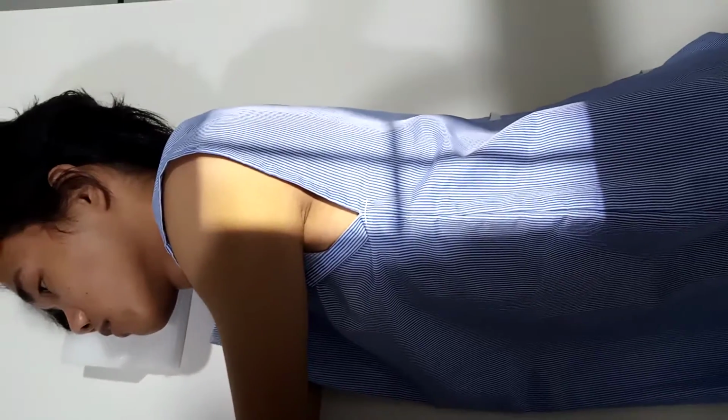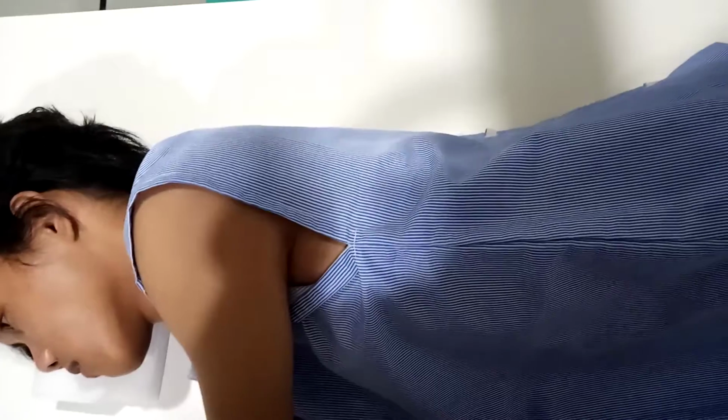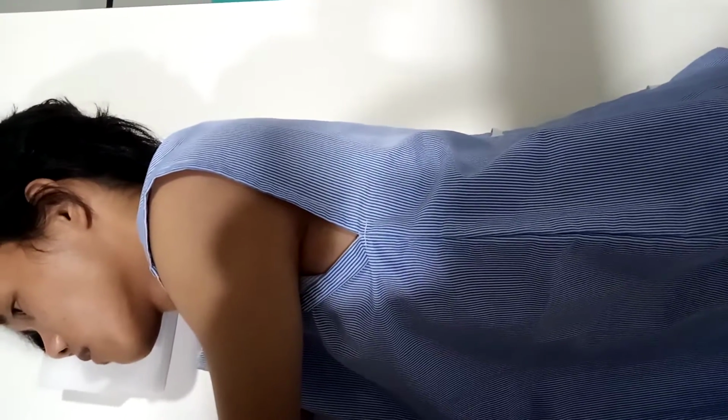Then, obtain a lateral image using a cervicothoracic or swimmer's lateral if the upper thoracic vertebrae are of special interest. Then, in position, intervertebral disc spaces should be open. There should be no rotation, indicated by superimposition of the posterior aspect of the vertebral bodies.